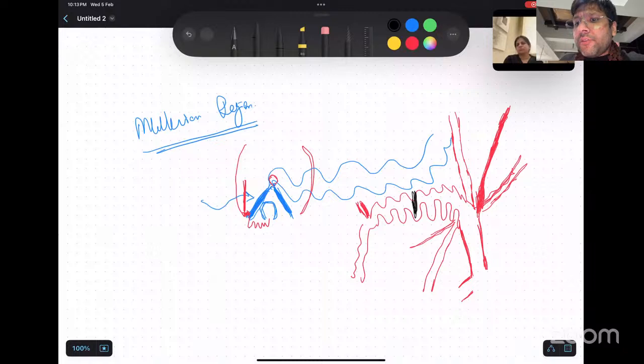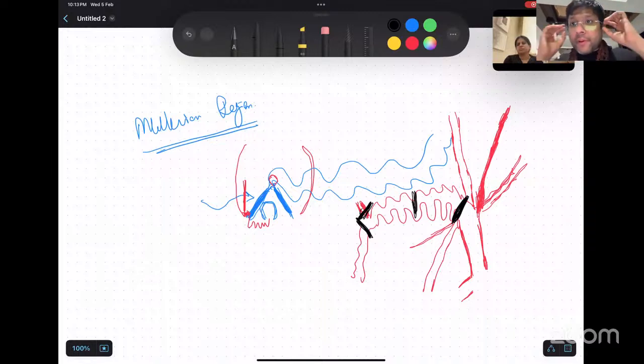In the middle of the curved part. Whenever we want to do something to the uterine artery, either we are taking the uterine at the origin where it is not tortuous, or in TLH, we are taking the anterior division and the posterior and the descending division. That means the ascending division and the descending division separately, isn't it? Never the curvilinear part, right?